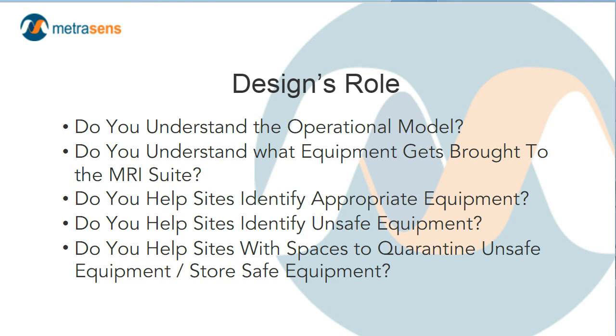Do the designers help identify what appropriate equipment to the MRI environment is? An architect or engineer may not like the idea of helping the facility with things like MR conditional wheelchairs or fire extinguishers or that kind of thing. But quite frankly, it is all part and parcel to the function of these physical environments that I believe the designer should take a more active role in.